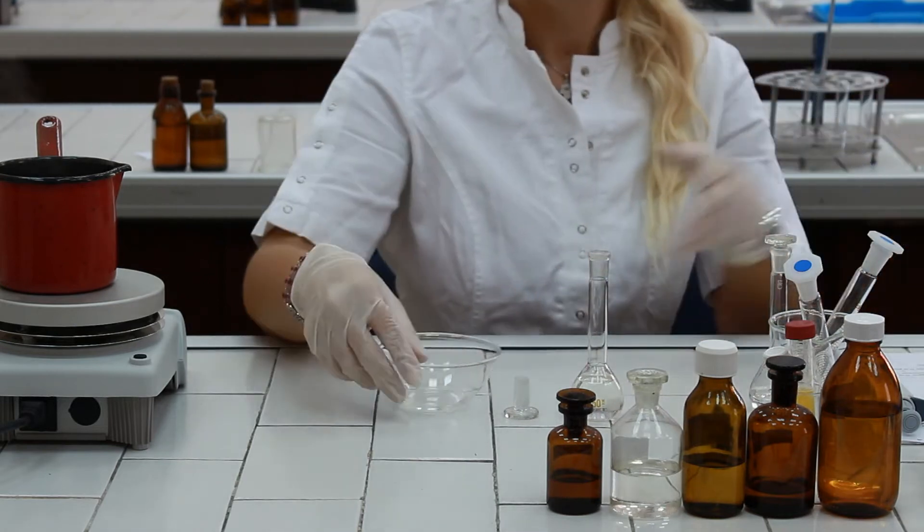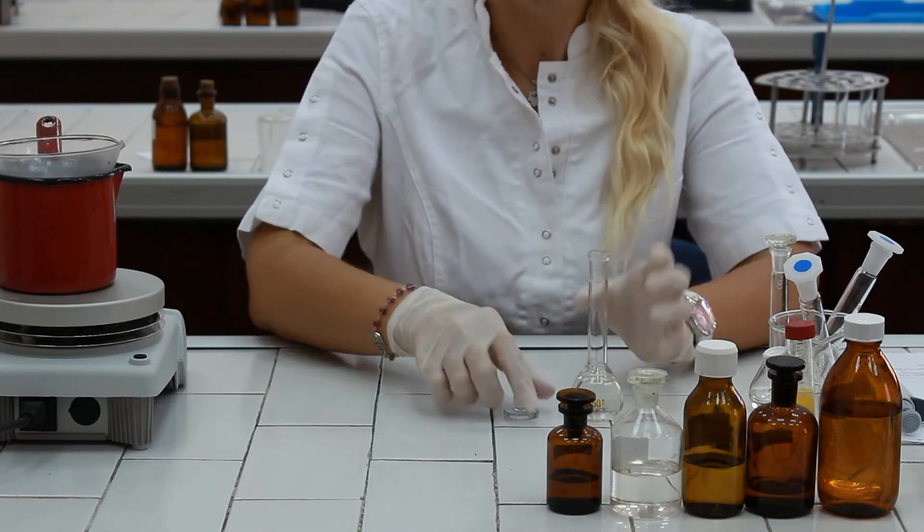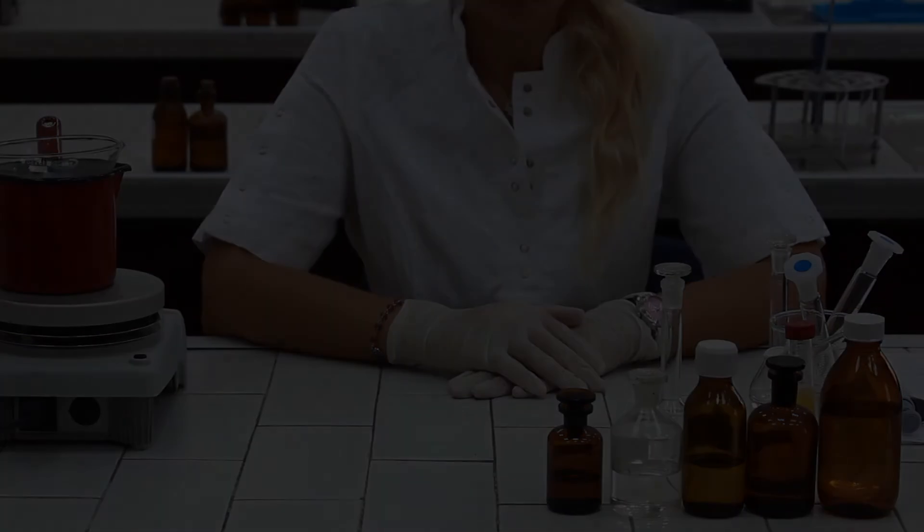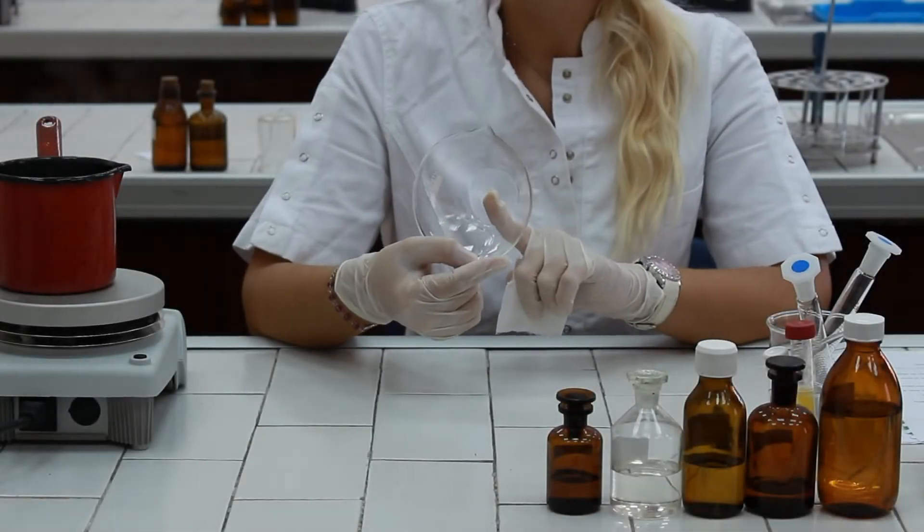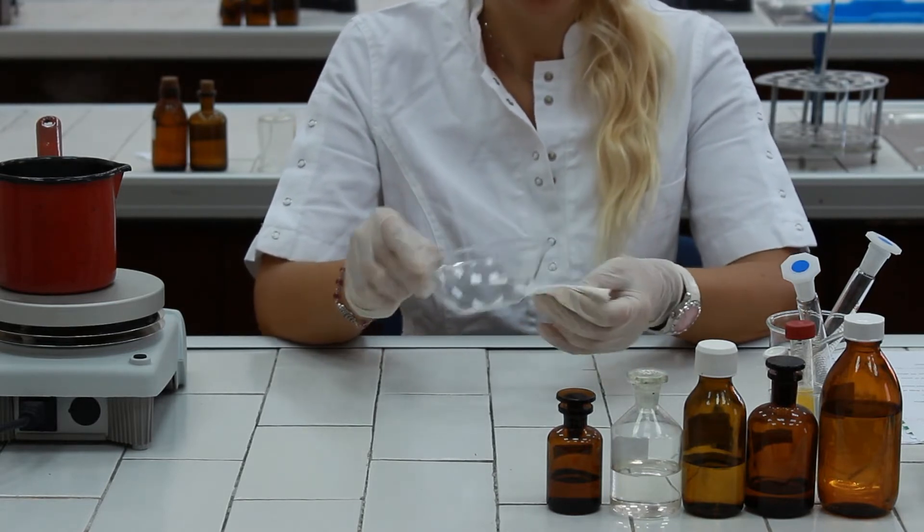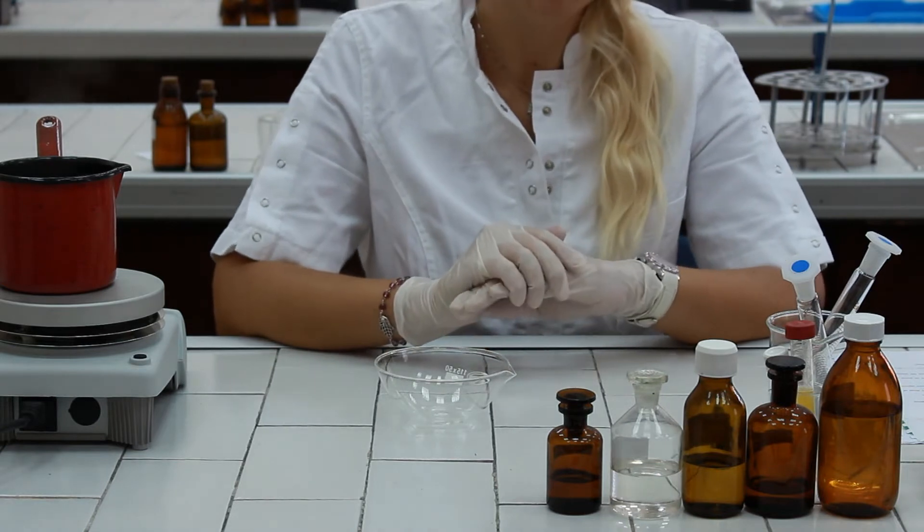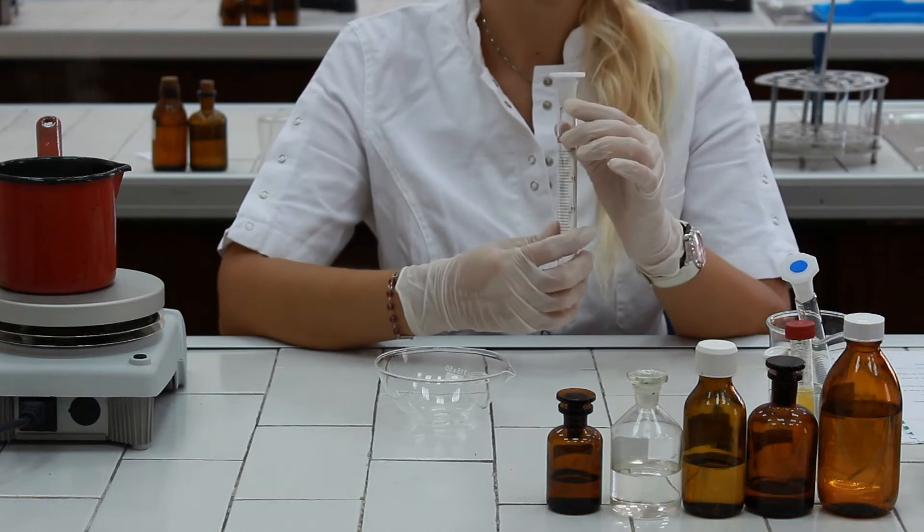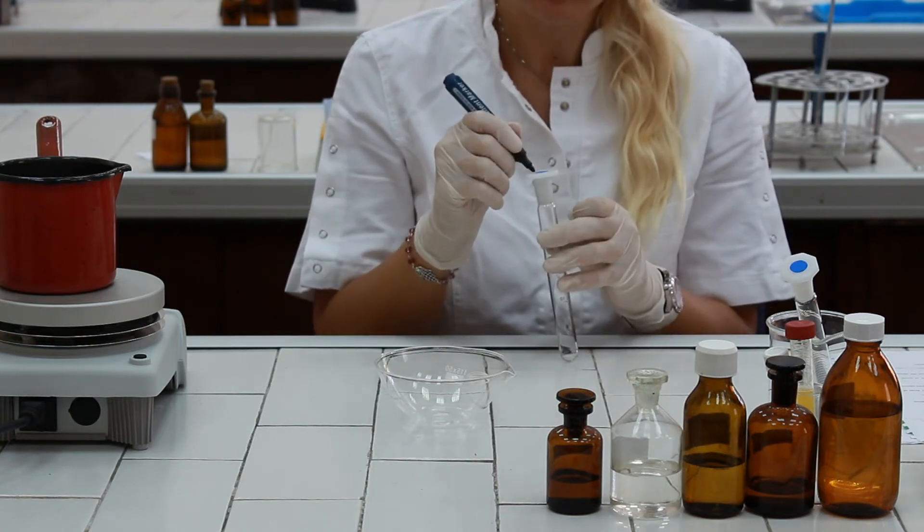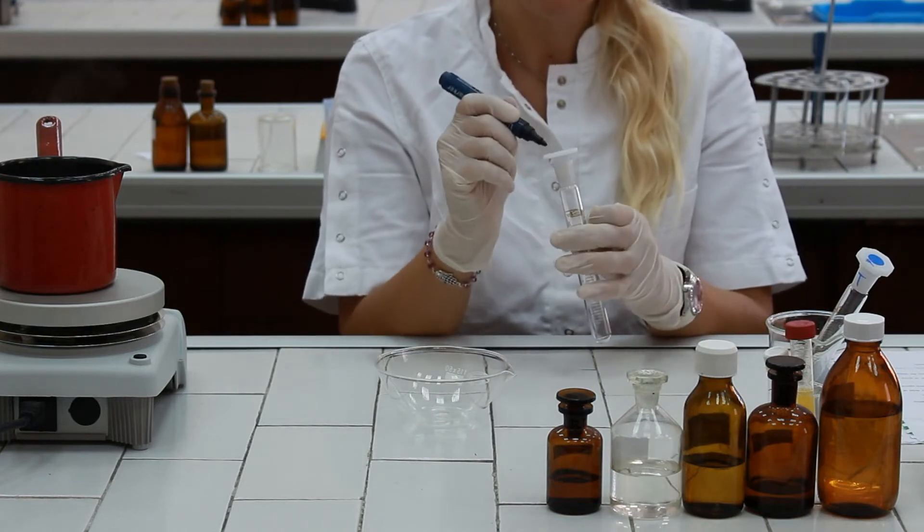Place the evaporating dish to the boiling water bath and leave until the complete volume of ether and ethanol mixture is evaporated. When the solvents are evaporated we should wipe thoroughly the outer sides of the dish in order to avoid excess water getting into our reactive system. Now we have to prepare two graduated cylinders. One cylinder we are going to mark with T as test and another one is going to be marked with S as standard.